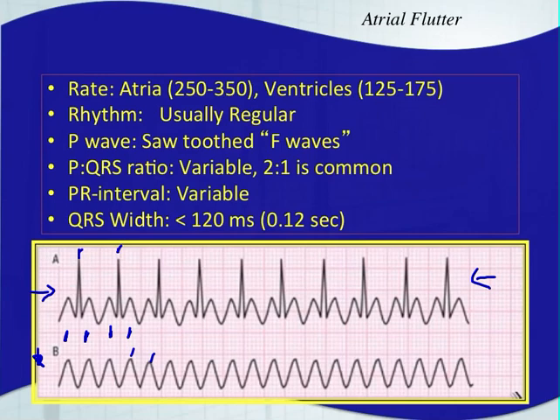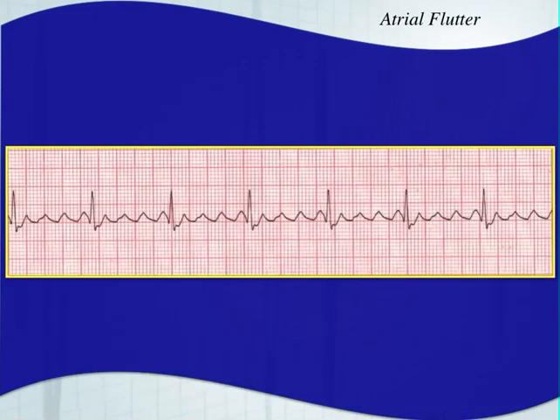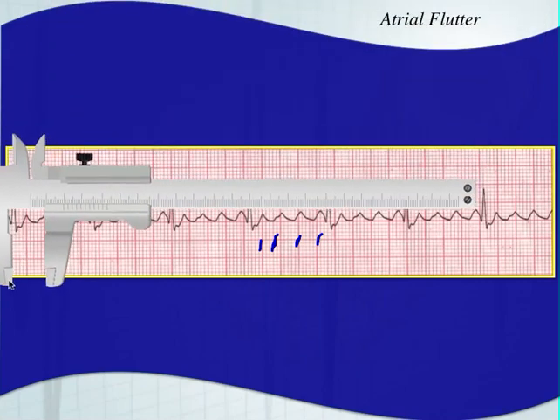We're going to have to revisit atrial flutter because it's such a difficult one to identify. A lot of times with these two to one flutters, people will see the first flutter wave as a T wave and the next as a P wave and think it's a sinus tachycardia. The way to identify it is by looking at many examples and covering up those QRS complexes to see that sawtooth pattern. Here's a good example — this one is a four to one atrial flutter. You have four flutter waves for every QRS complex, and covering up those QRS complexes makes it easier to see the sawtooth pattern.